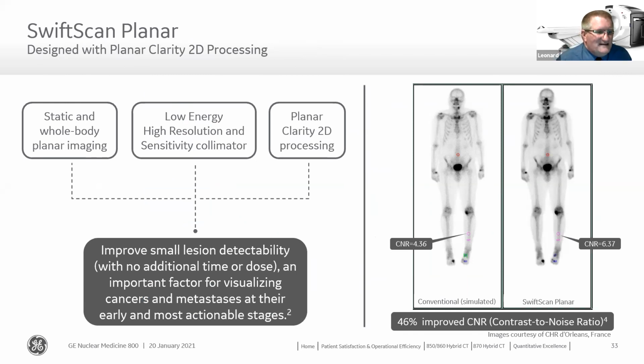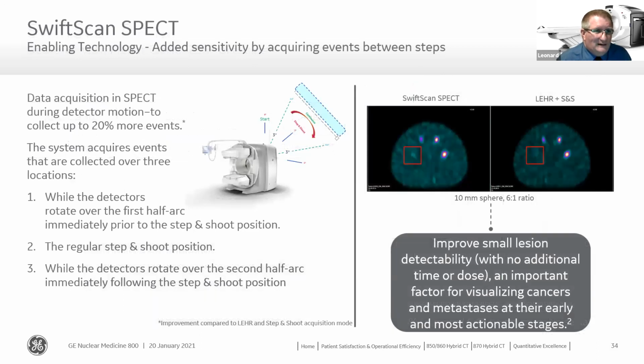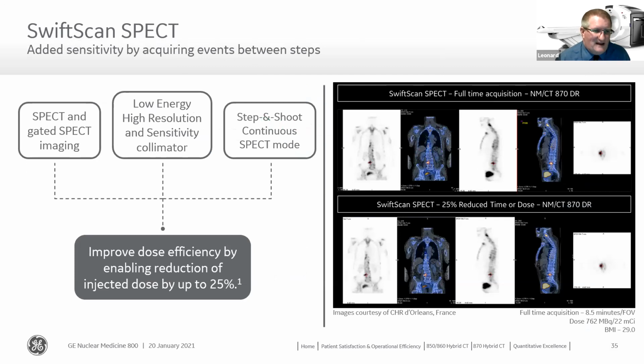And this is our latest implementation, where we started with these literally at the beginning of last year. So this is very new technology, but it is now current. And we utilize that for SPECT imaging as well. These mean that we can do a SPECT acquisition now within about 5 minutes to 7.5 minutes. So it means we're getting a lot more accuracy and doing reviews.